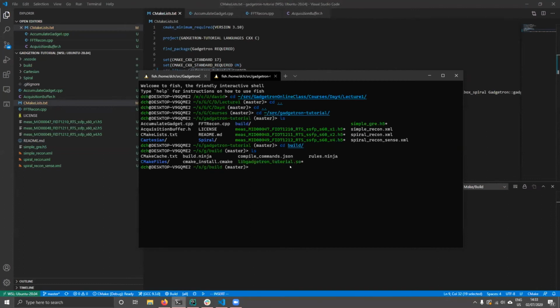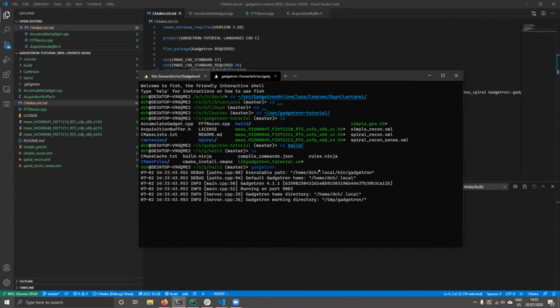Excellent. And we want Gadgetron to be able to find that. Now, we could do that in a number of different ways. You could modify the LD library path. We could install this SO file inside our lib directory where Gadgetron is installed. But right now we're doing development. We don't want to bother with all that. So we're just going to start Gadgetron right here next to the SO file.